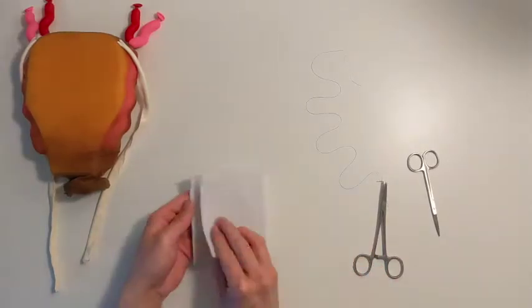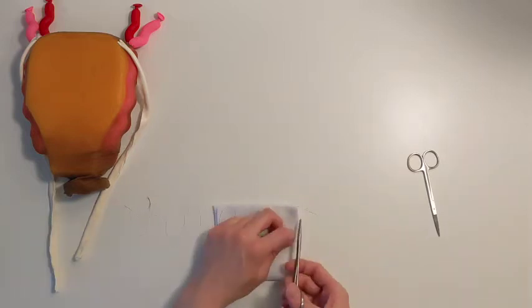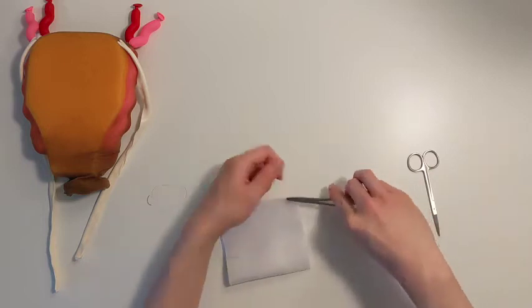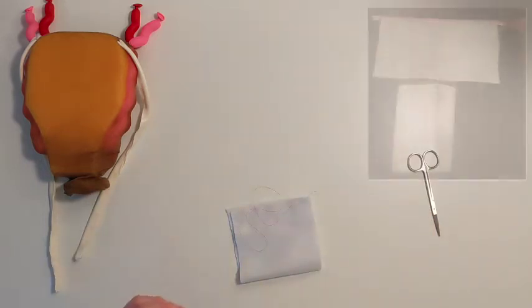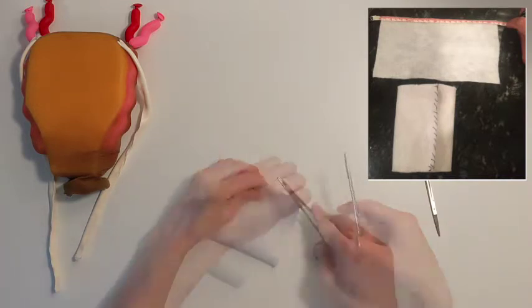Next, we will develop the vagina out of white felt. Cut a piece of white felt using an 11 by 21 centimeter rectangular stencil. Then fold the felt in half. Sew the 2 ends of the felt together either with a suture or needle and thread. This step can also be done with a stapler.